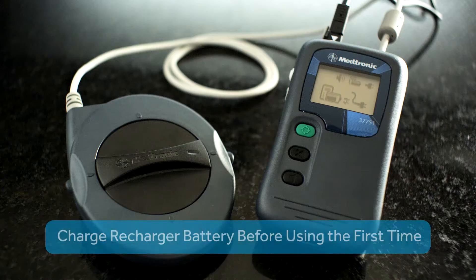Now let's begin and show you how to recharge your recharger battery. Remember, you'll need to charge the recharger battery before you use it for the first time. You need to do this because the recharger battery may have run low since it was manufactured and shipped.